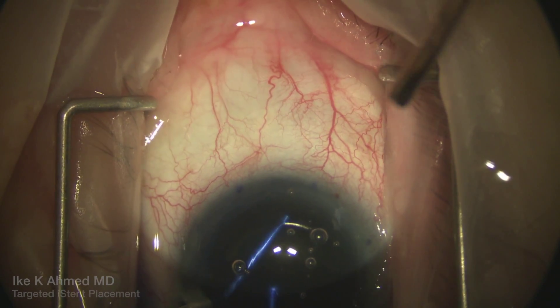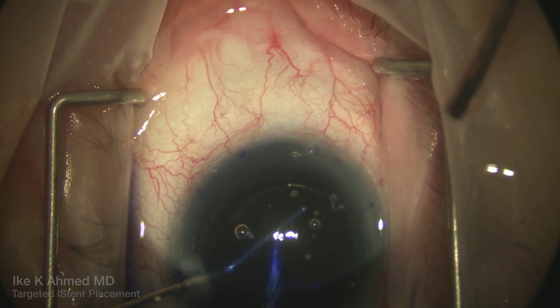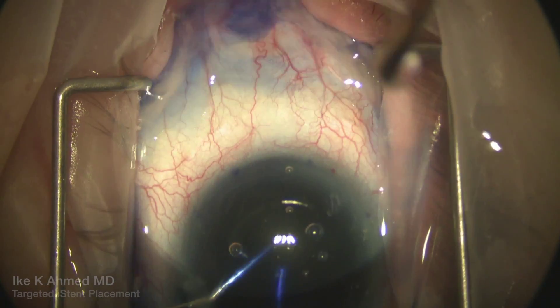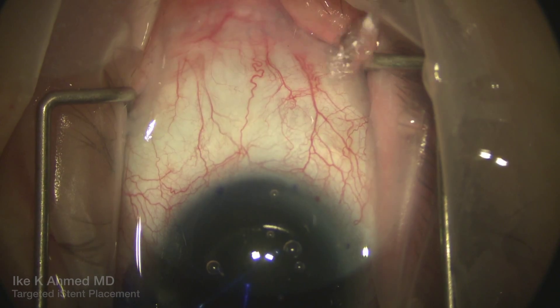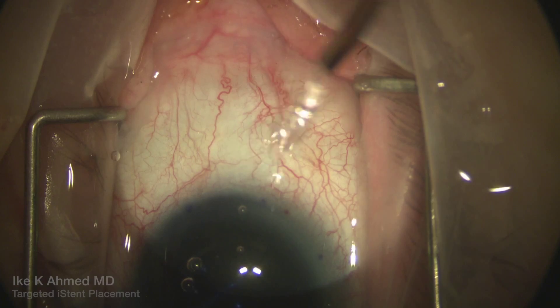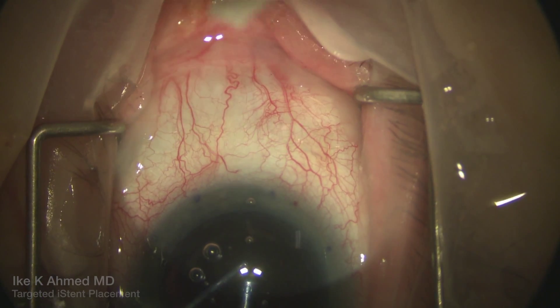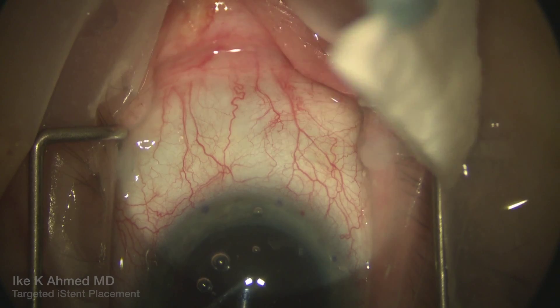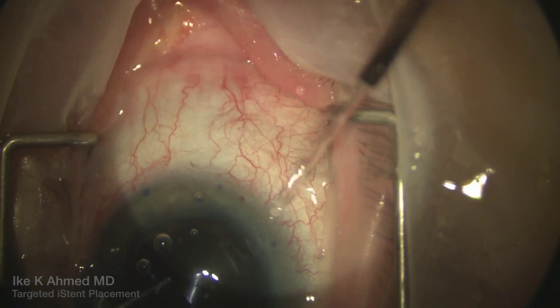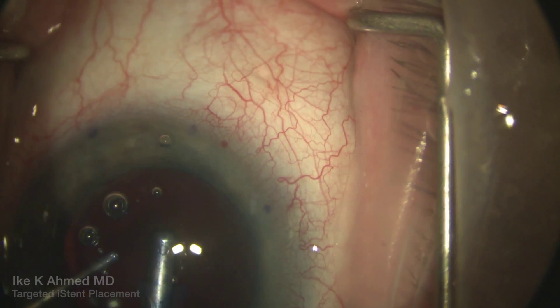We inject some trypan blue again, and we see there's now some uptake in those aqueous and episcleral veins, showing excellent patency within the system. This further adds proof that we've now provided a direct bypass of aqueous into the distal outflow system — those aqueous veins and episcleral venous plexus, the superficial plexus present in this video.